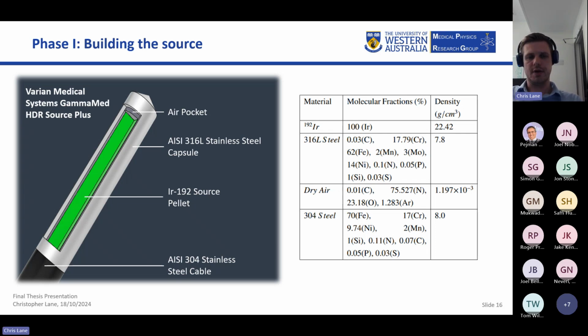Then I imported the STL files into TOPAS, and that worked fine, but there was some history loss due to some mesh collisions. Because this thing is relatively simple, I was able to just use the inbuilt G4 geometry to generate it from half lengths, and that was a lot simpler.